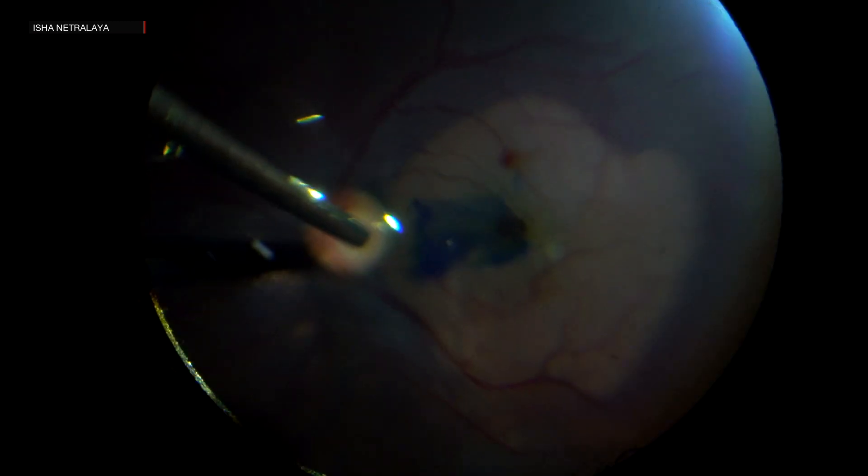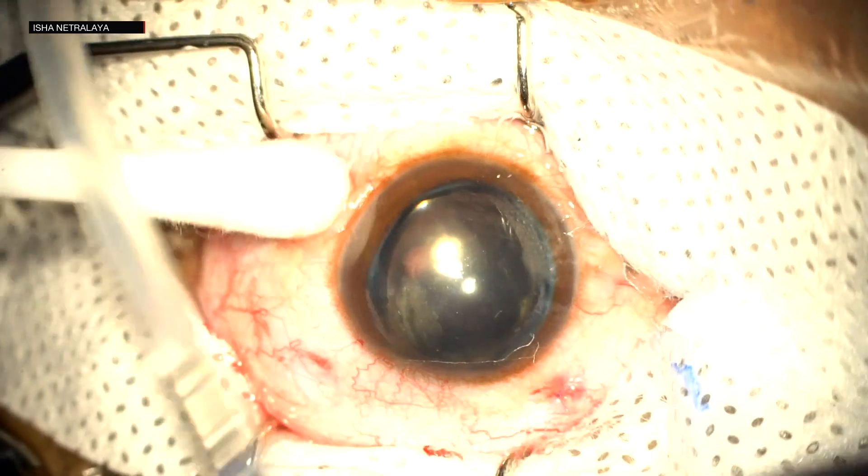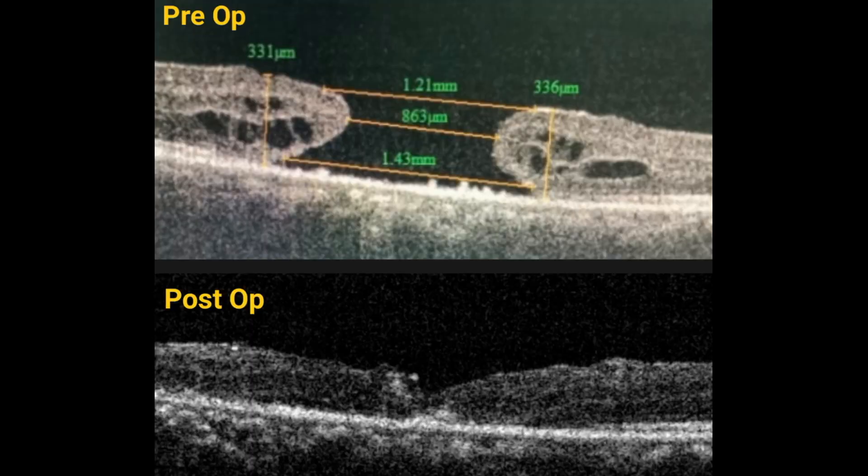During the fluid-air exchange, the fluid was kept nasal to the optic disc to prevent graft displacement, and due to this, the need for other maneuvers to keep the graft in place was avoided. The case was closed under gas tamponade. Here we can see the pre- and post-op OCT images. The best corrected visual acuity was 6/36 at one month follow-up.